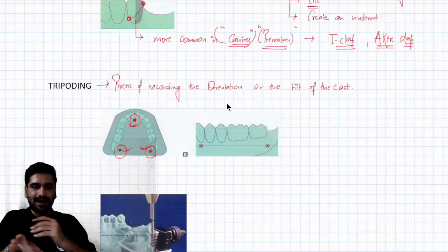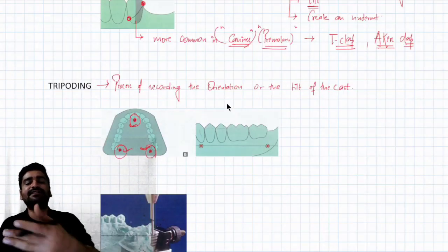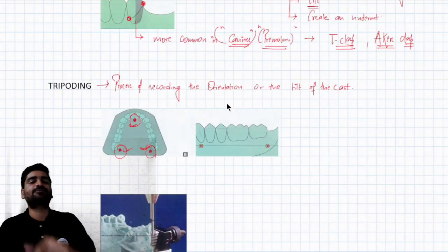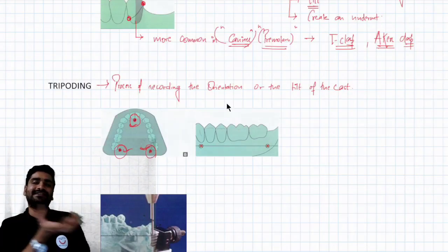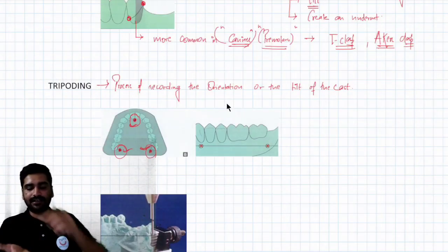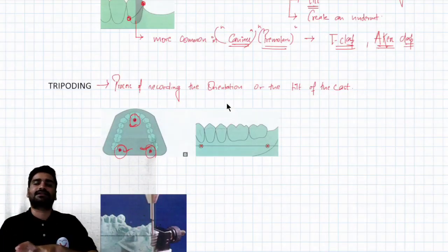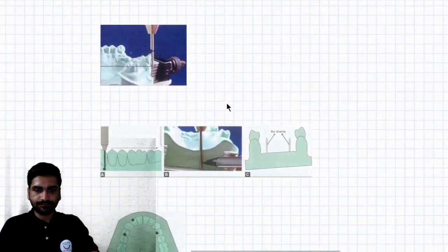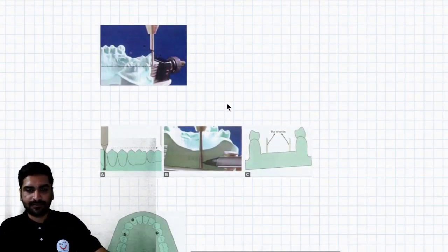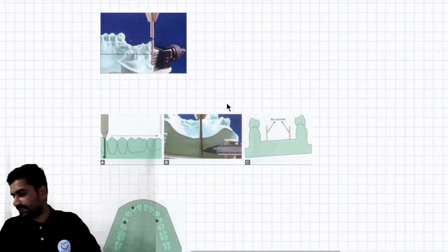So once you mark, then if you have another patient of cast partial, you cannot keep the same tilt. No, for every patient the tilt will vary. That is why these markings are useful. So for this patient, markings are there. When you have the master cast, you take the diagnostic cast, orient the cast holder and the tilt, and then place the master cast, so that your planning remains same, correct? Apart from that, you can also mark on the surfaces of the teeth also, right?